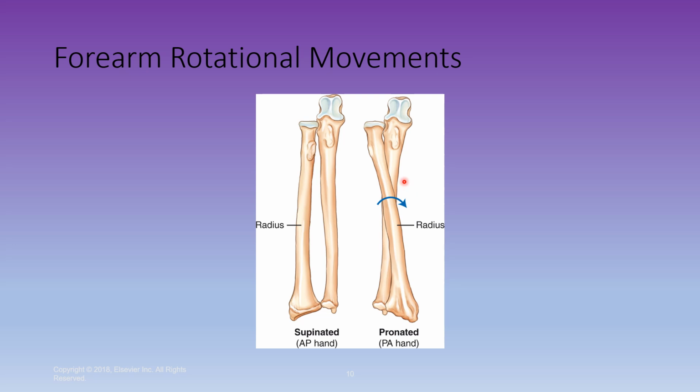Okay, this crossing over is because of the proximal and distal radial-ulnar joints. So when we do a forearm, we do an AP forearm with the hand supinated, palm up, and the elbow is straight as well, and that will allow visualization of the radius and the ulna independent of one another. Okay, so this is figure 4.25 on page 132, and this is correct, this is incorrect as far as positioning goes.